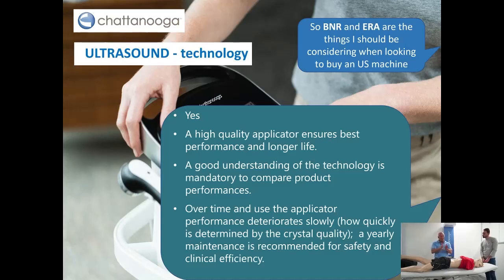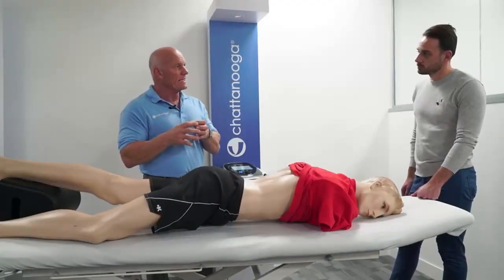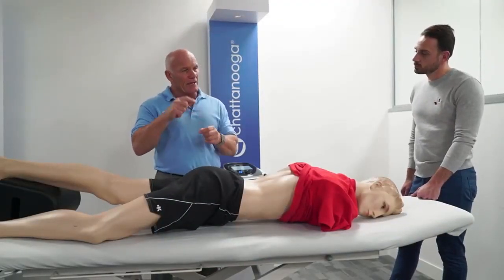But that is why, because of that deterioration, most professional bodies tell you to have your machine checked once a year by an engineer, okay? And they will measure the output to make sure it's correct. Okay?